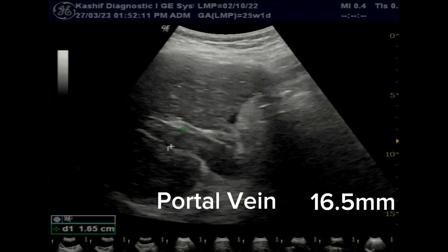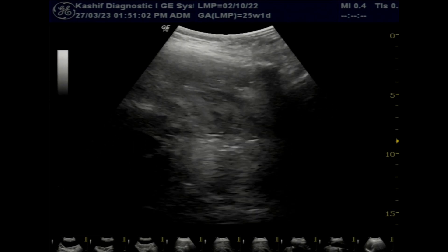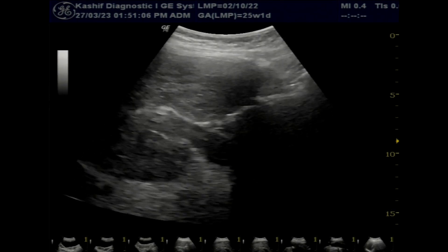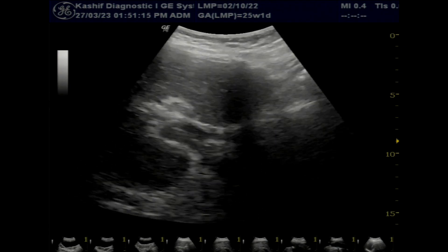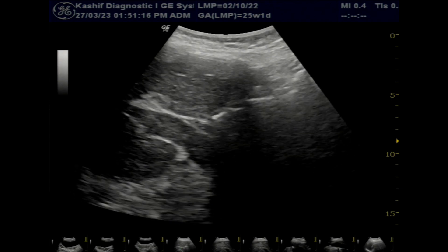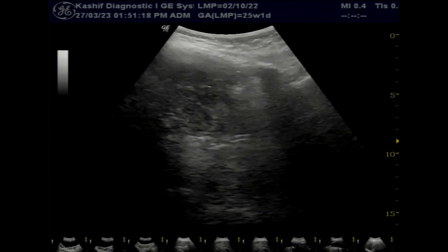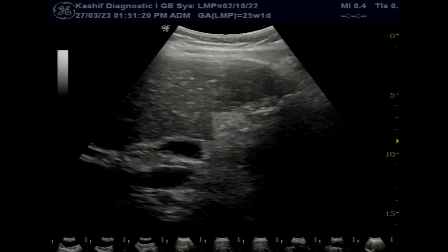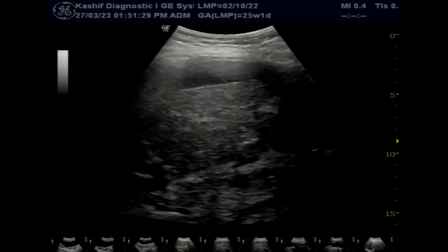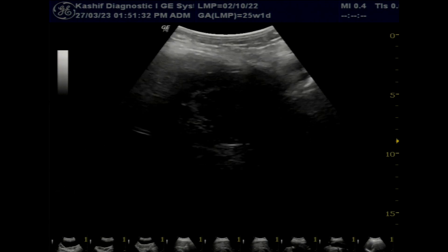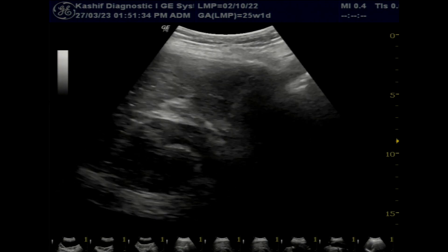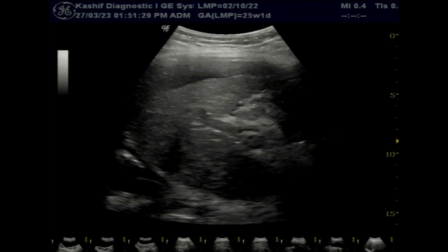Portal vein thrombosis in this case is mainly located in the main portal vein. It can extend into segmental hepatic branches, and in severe cases, if thrombosis extends up to the superior mesenteric vein, there can be bowel ischemia. Portal vein thrombosis frequently occurs with cirrhosis of the liver, more commonly in viral cirrhosis. Other causes include malignancy, abdominal sepsis, and pancreatitis.